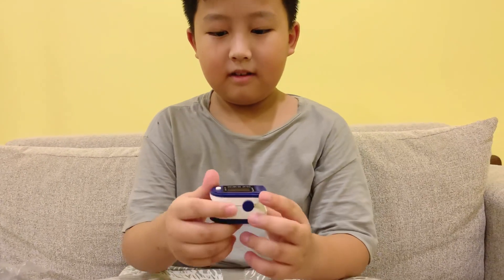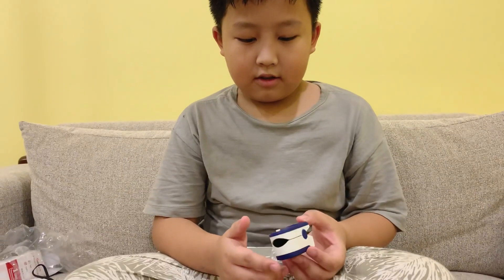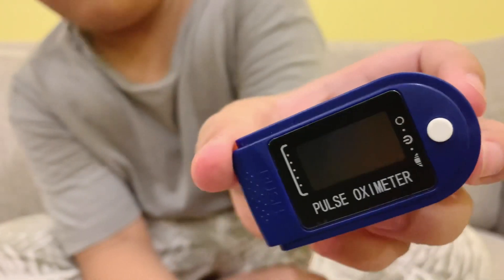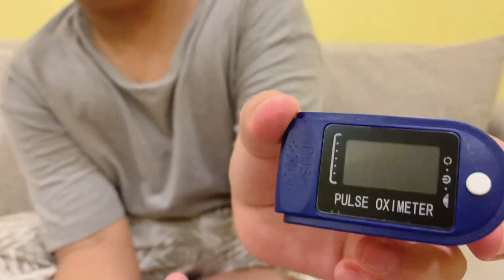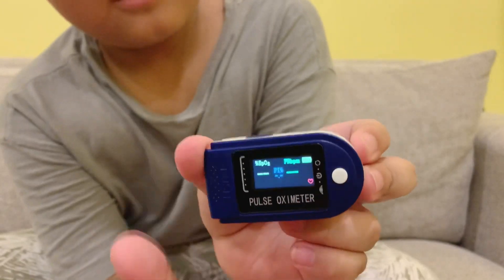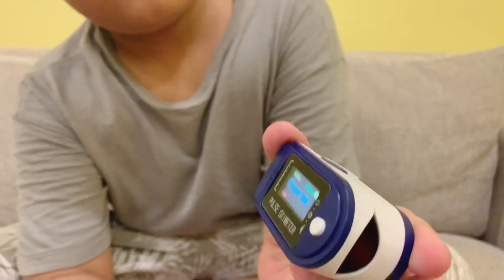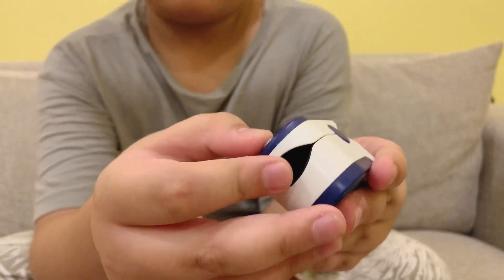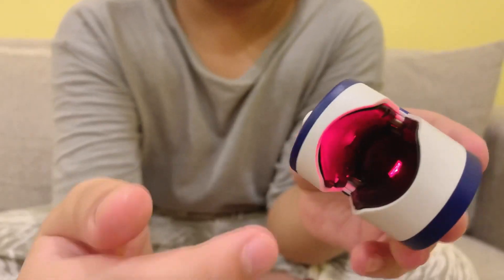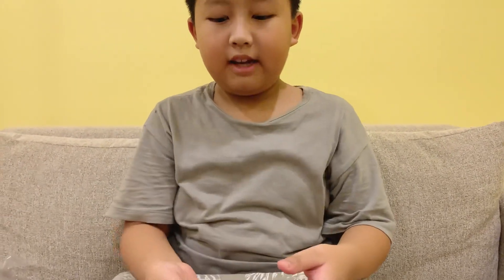There we go. I think we press this button. The pulse oximeter shows how much oxygen level is in my body. Press it — oh, it says 'finger out' because there's no finger inside it. There's a light inside, so what you do is put your finger in like this and take a deep breath.